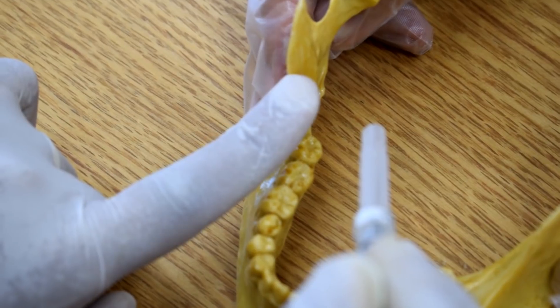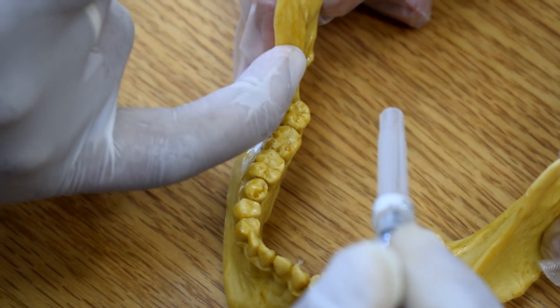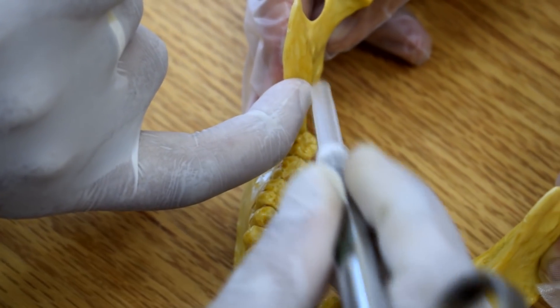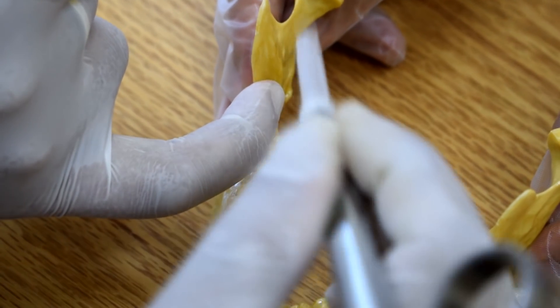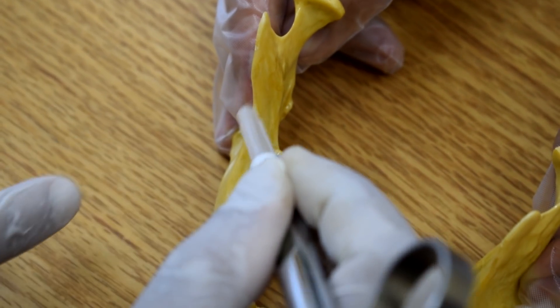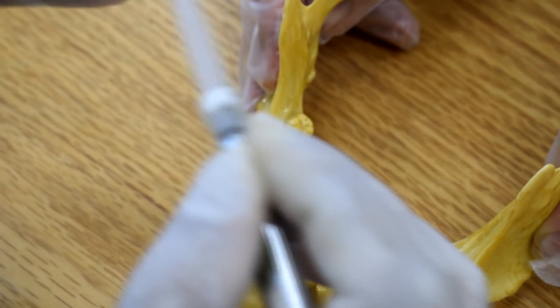Until I find the most concave area, here. Only at this point I have to turn my finger so that my fingernail will face medially. What I am feeling here — I am feeling the external oblique ridge and the internal oblique ridge, both of them, at my finger bed.